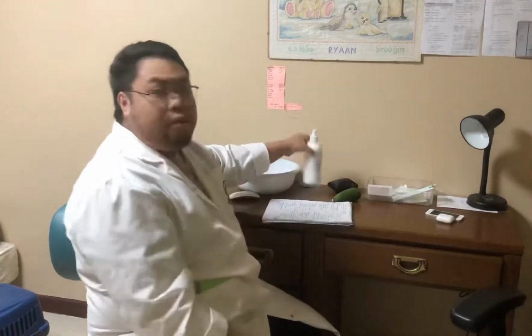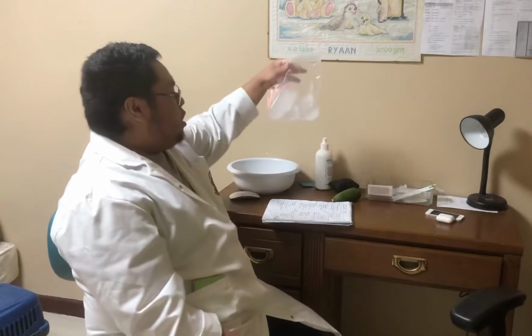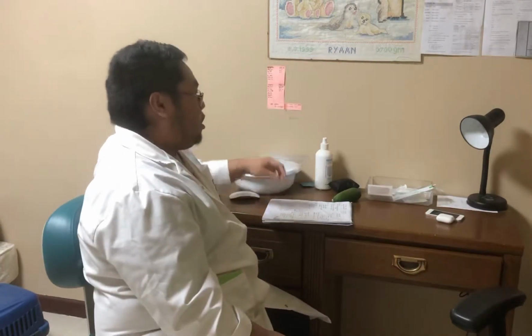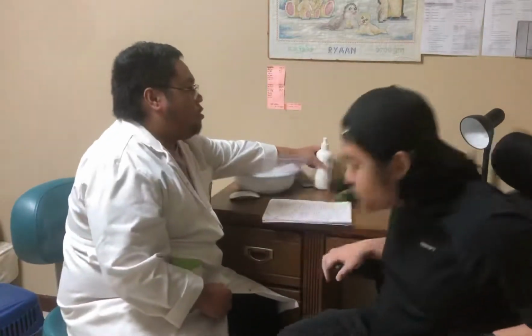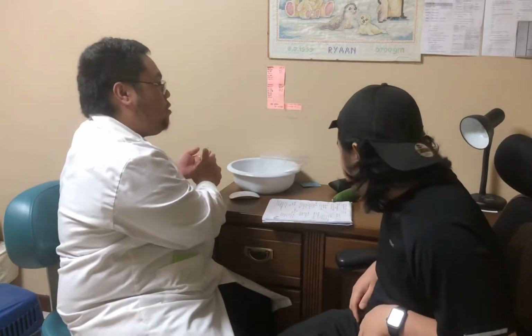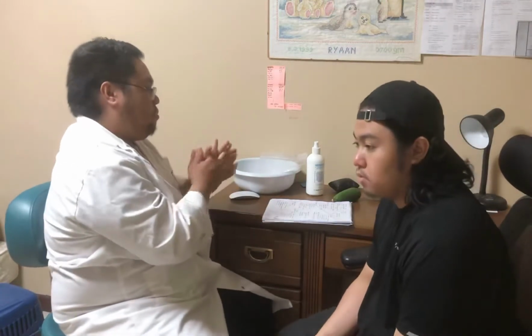And here we have our alcohol solution for proper hand washing and hand hygiene, and your bag of ice for laboratory transportation. So now let us introduce ourselves to the patient. Before introducing yourself to a patient, make sure to perform hand washing in order to reduce the numbers of microorganisms and the risk of any contamination or spread of microorganisms.